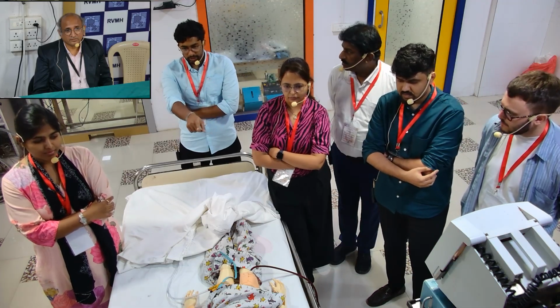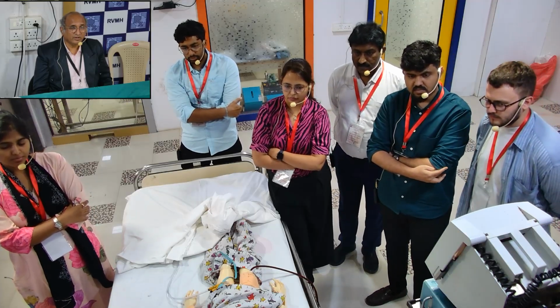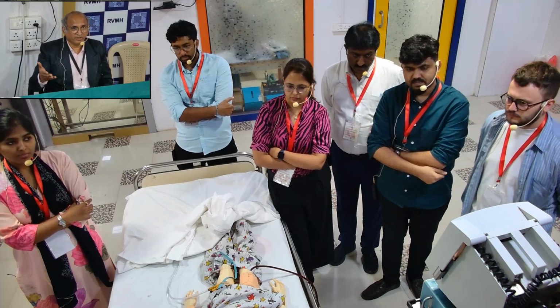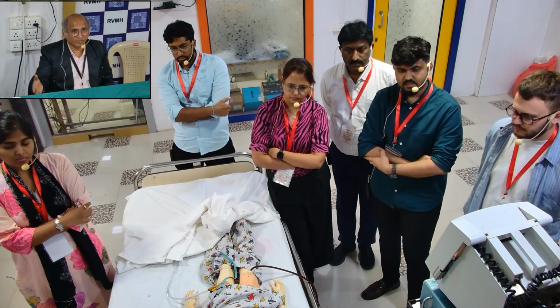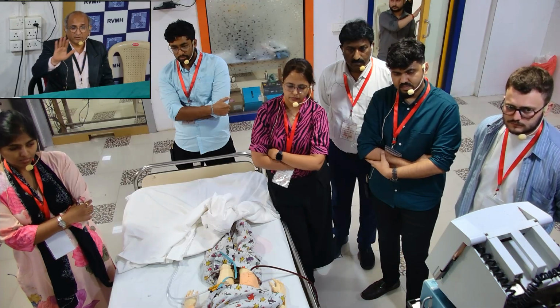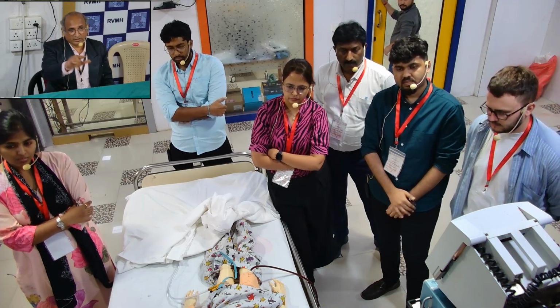How do we diagnose the venous clot, sir, in the circuit or the cannula inside the body? So again, P1 will become more negative. With the same RPM, the flow has gone down, with chattering. So it means there is something wrong, and there is no kink, so there is a clot somewhere, either in the pump or in the cannula. Because P1 has become more negative, most probably it is going to be in the cannula, when you cannot see it outside.